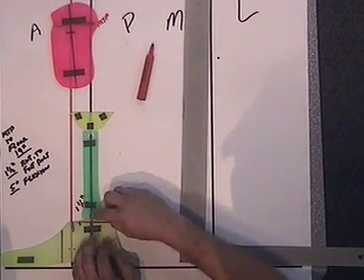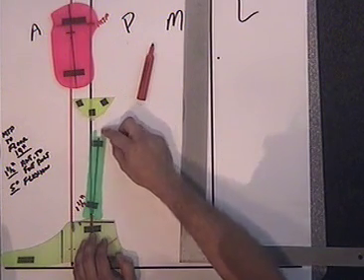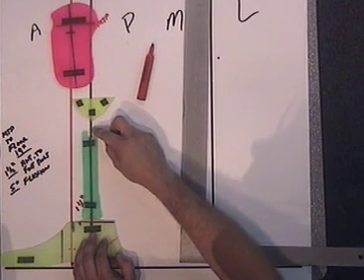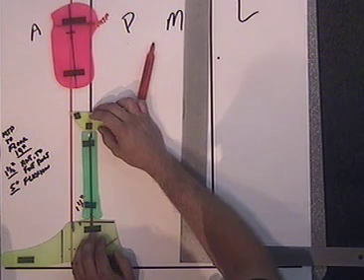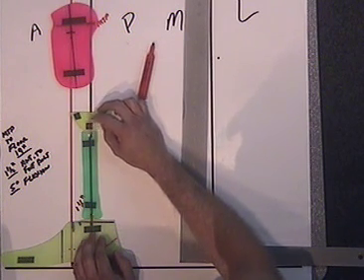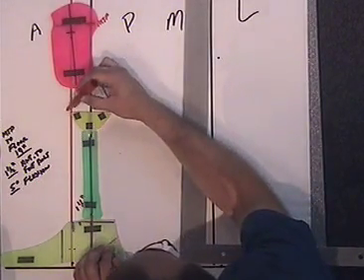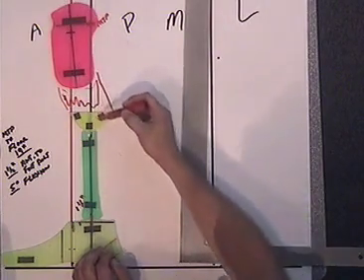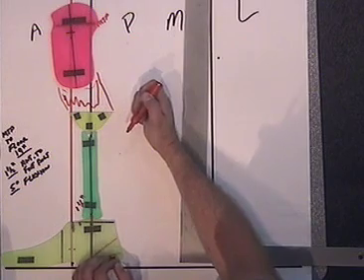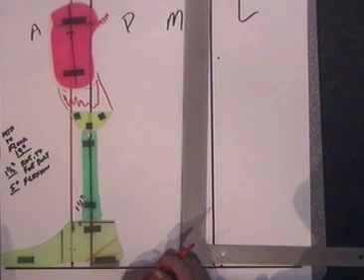So this pylon, you can see I've placed on here vertically. I haven't placed it so it's tilted posteriorly or anteriorly, but it's vertical, and that's important. And then we've placed our socket attachment block here, and then what we do in the real world is we just go ahead and foam the difference between here and just fill this area with foam to bond the socket to the attachment block.